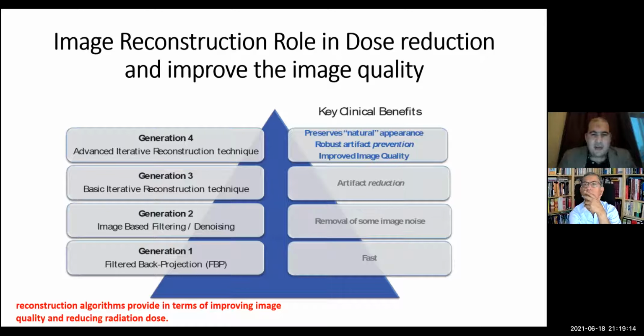Okay, I'll continue in brief on the role of image reconstruction in dose reduction and improving image quality. So I'll talk about image reconstruction without a lot of mathematics. You will find a lot of mathematics when talking about image reconstruction algorithms for filtered back projection and for iterative reconstruction algorithms, but I really want to talk about image reconstruction algorithms from the patient dose point of view and the image quality point of view. Okay, so we have four generations of image reconstruction algorithms.